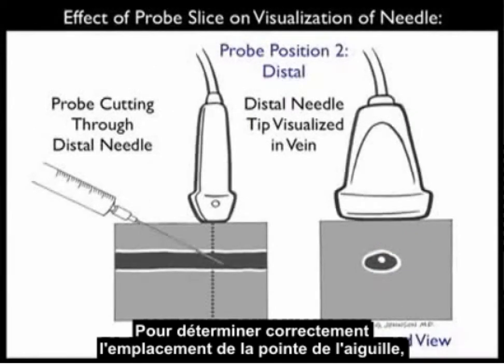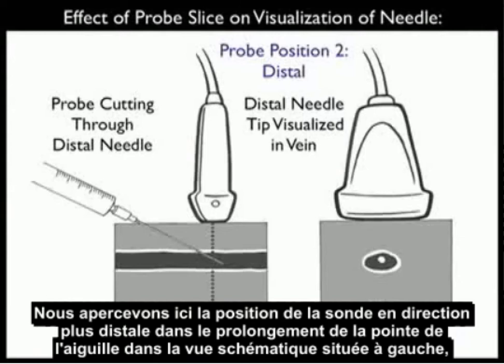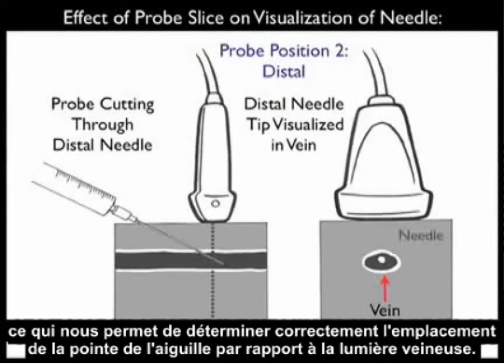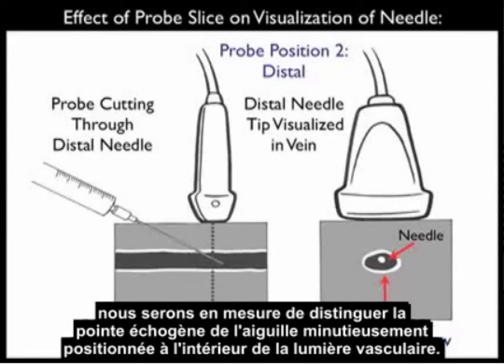In order to accurately determine the location of the needle tip, we need to move the probe more distally as we advance the needle into the patient's neck along the course of the vessel. Here we see the probe positioned more distally, now in-plane with the needle tip in the schematic view towards the left, and there we can see an accurate determination of the location of the needle tip with regard to the venous lumen. In the ultrasound view towards the right, we'll now be able to see the echogenic tip of the needle accurately positioned within the vessel lumen.